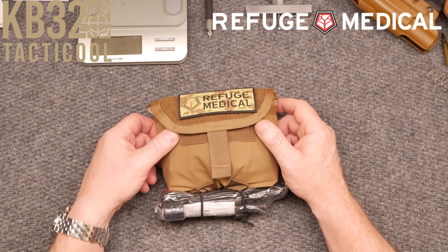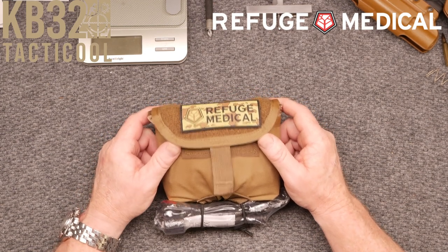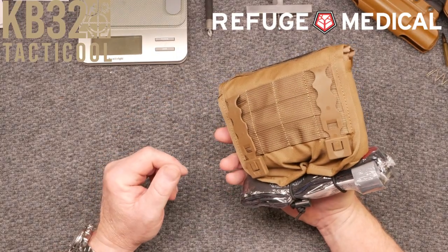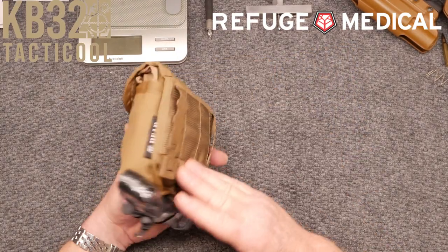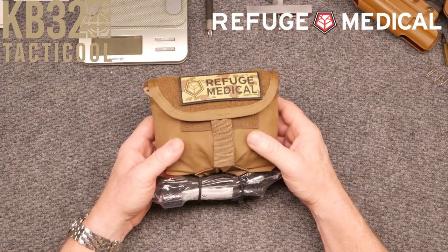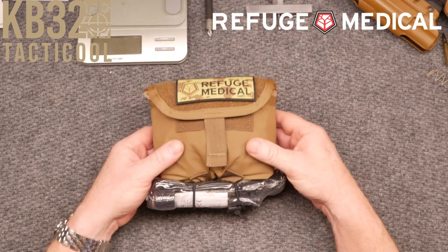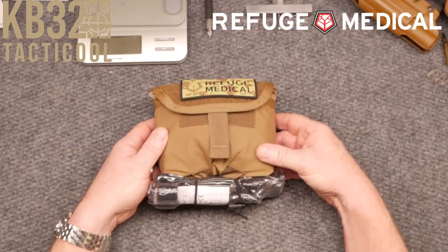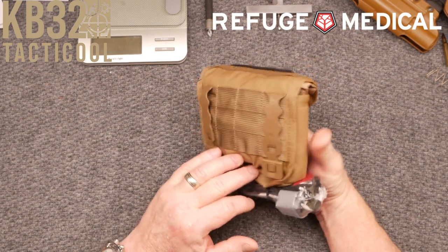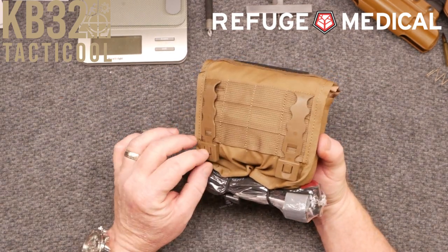They've got a bigger story and I want you guys to go to their website — refugemedical.com. They sent me a couple of their different kits and we're going to do a video for each one. This is going to be the one that goes on that belt system. The cool part is that it ties into the MOLLE webbing system right here via the tabs.